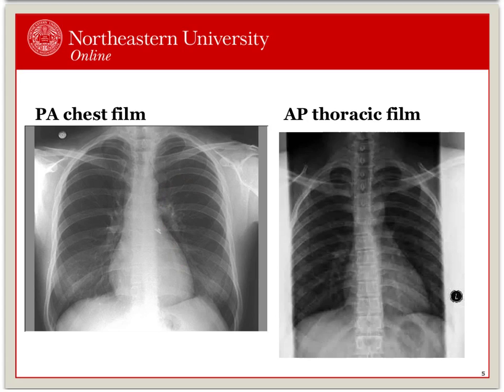On an AP view, the heart always appears enlarged, so it is not useful for the purpose of the cardiothoracic ratio. Image 2 is an AP of the thoracic projection with increased contrast, allowing for better visualization of the spine, the spinous processes, and the posterior ribs as compared with the chest PA.